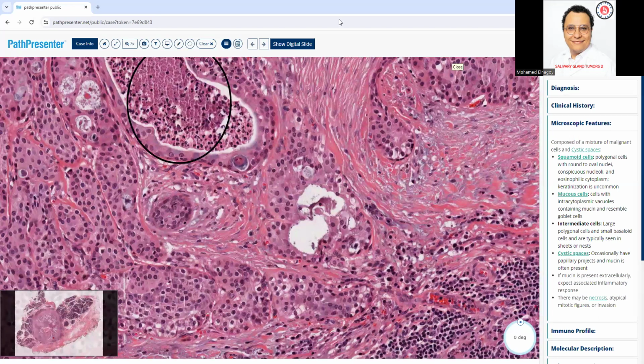So this is how virtual slides look. Virtual slides are a very tough experience, and actually this is the one that I'm worrying about more in my board exam. I'm not worrying about the pictures. I'm worrying more about the virtual slides. I hope that they give clear-cut cases and won't try to trick us or give me a case that needs careful examination, because we won't have time for this. Yeah. So I have a question.